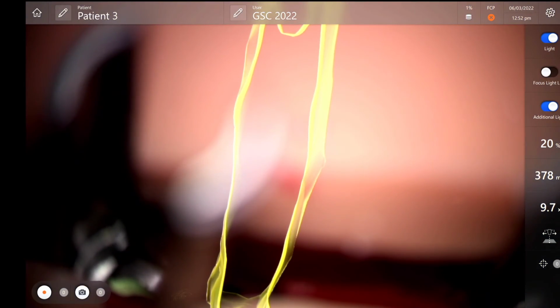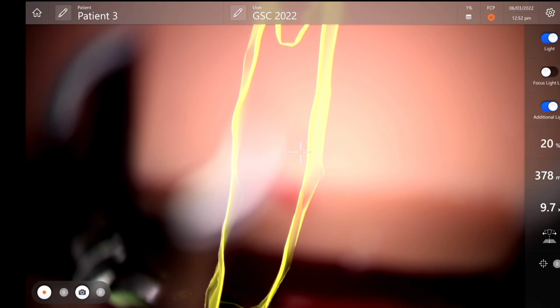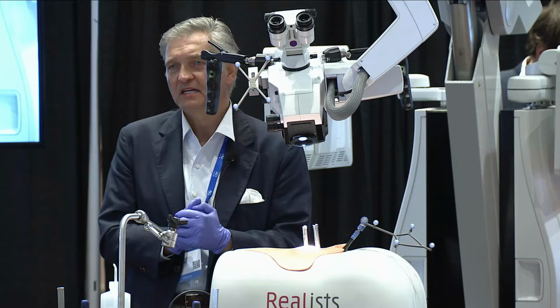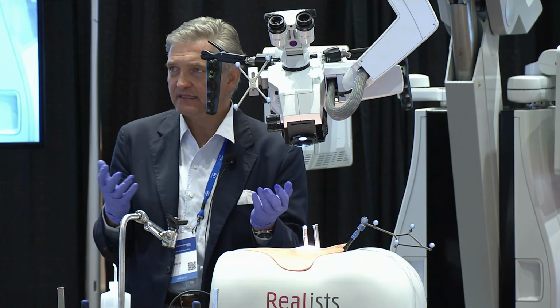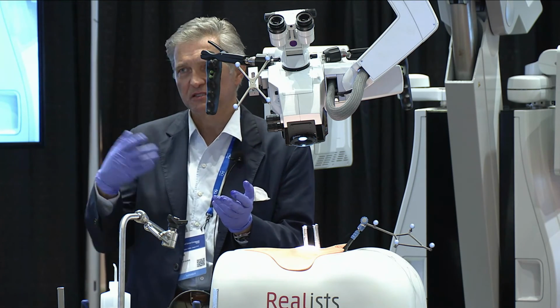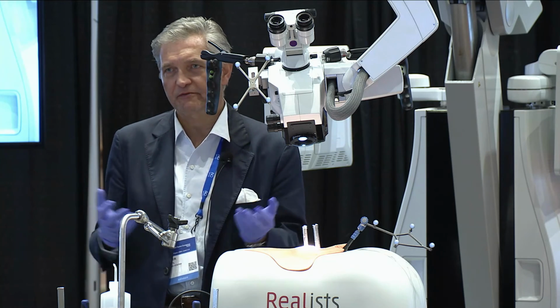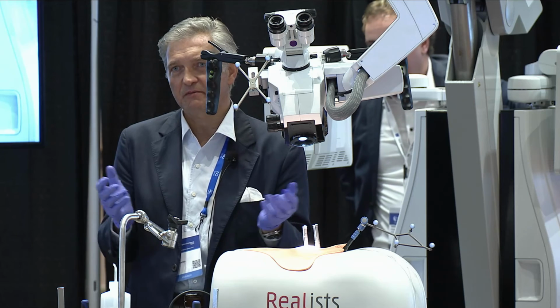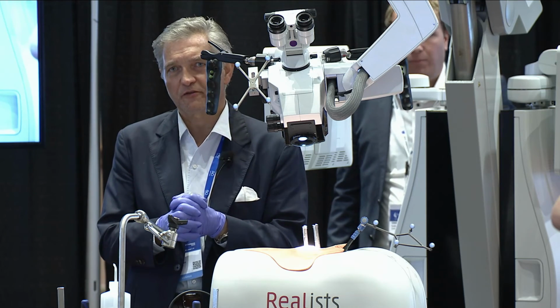So that's really the MIS TLIF, the way I do it, and some of my partners do it. Again, I like putting in the screws first because the accuracy is greater. I like to rely on navigation. You got to modify your workflow a little bit. But I've never had, maybe there's sometimes a case where you have to re-register, but I've never had to bring in fluoroscopy. Nobody wears lead. It's a very, very elegant and very streamlined workflow.